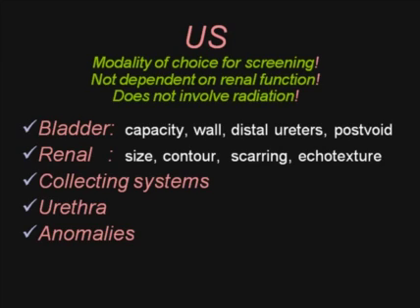It's important to examine the bladder in the beginning of the examination so that one can assess the capacity, the wall, the distal ureters, and then ultimately measure the post-void. Many children will empty their bladder as we come near them to scan them, and so if that happens, you can just give them a bottle or a drink, and by the time you're done examining the kidneys, the bladder should have refilled.